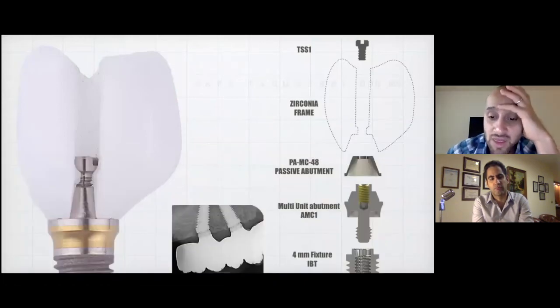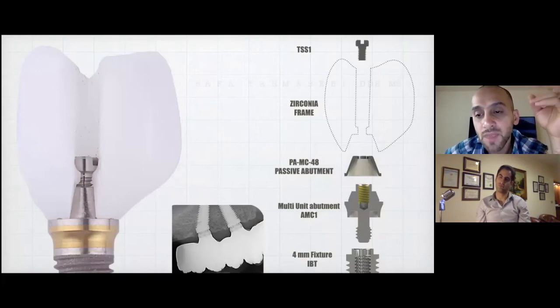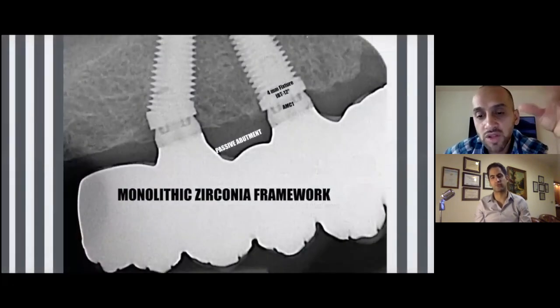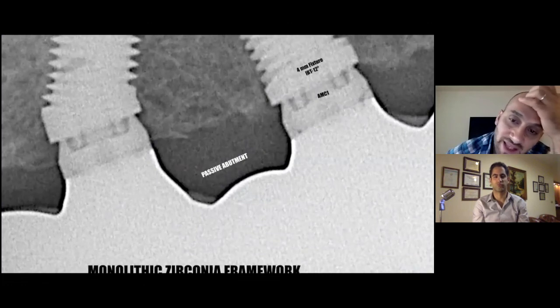So when I started doing this, I said, well, why can't we apply this to full arch restorations? And that's absolutely what we did. So the same concept is applied for the passive abutment for cement retained restorations, for full arch restorations. But the only difference here is that the passive abutment does not have an engaging component, so it's non-engaging. So for full arch restorations right now, I restore most of them with the passive abutment, and look at these beautiful bone levels that you can achieve because of these connections. That's the passive abutment right there. You could see it in the arrow, and the connection is perfect.